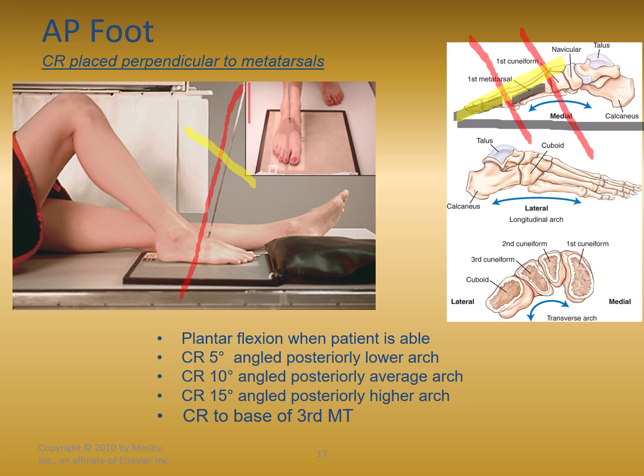So, like you got the collimator box here, like that. Try to visualize that flat surface of the collimator box being in line, parallel with the top of the patient's foot. And that's a visual way that you can judge how much you may need to angle more or less for whatever patient you're doing.